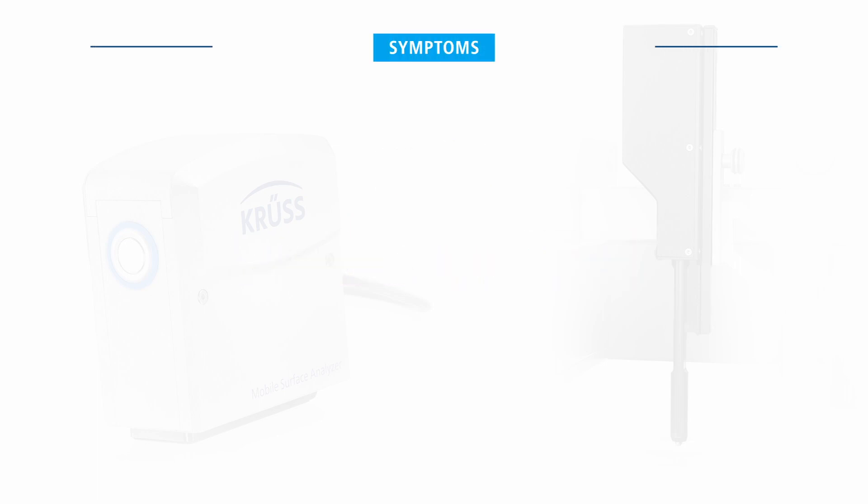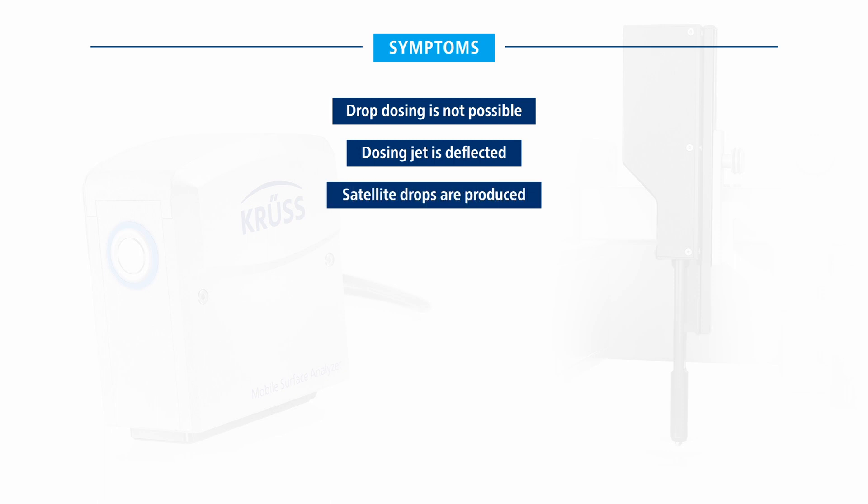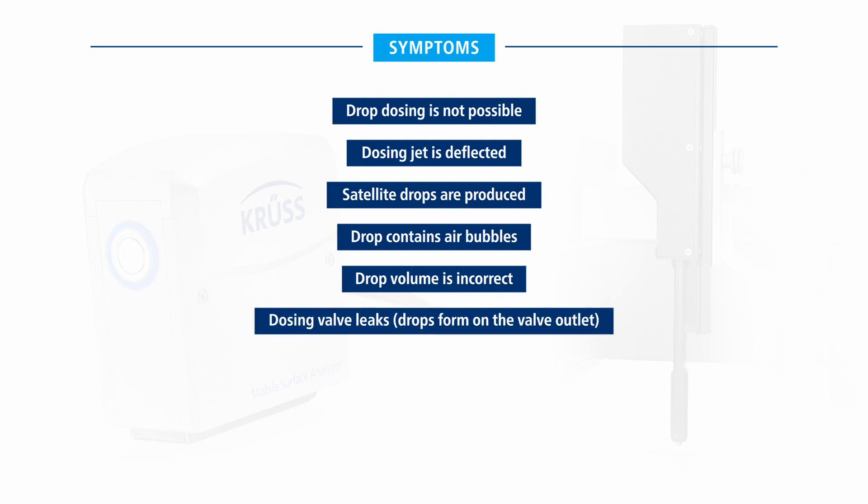The following symptoms indicate that the dosing valve is blocked: drop dosing is not possible, the dosing jet is deflected, satellite drops are produced, the drop contains air bubbles, drop volume is incorrect, the dosing valve leaks, or drops form on the valve outlet. If any of these symptoms occur, clean the affected dosing valve.